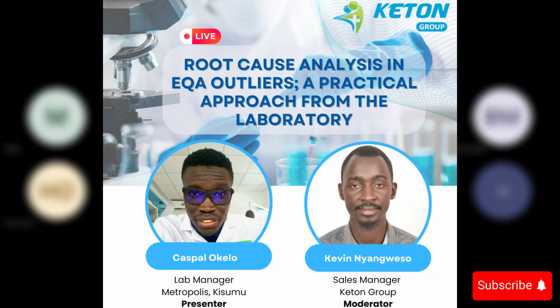If both tests were run within 5 minutes, it's unlikely to be a calibration problem, a reagent lot bias, or an analyzer systemic bias, because if it were any of these systemic issues, it would affect both of your samples similarly.